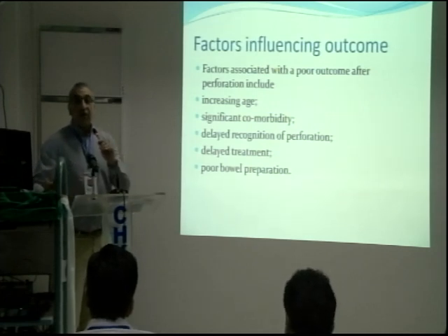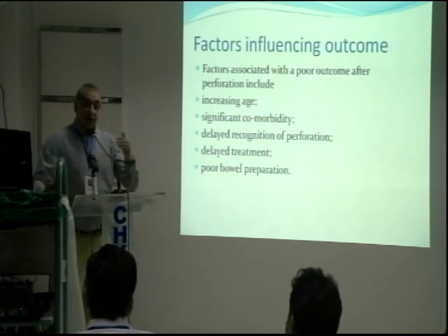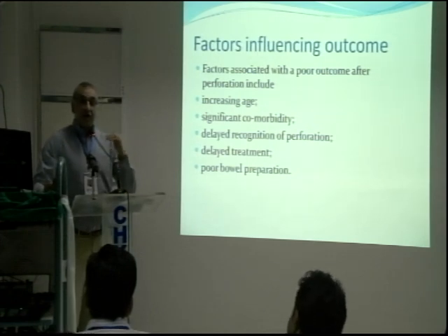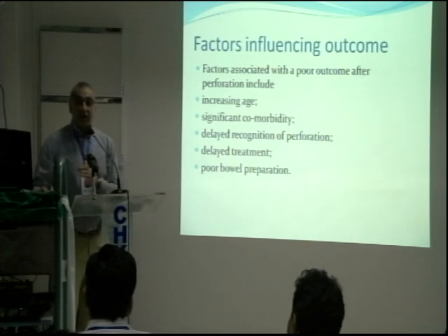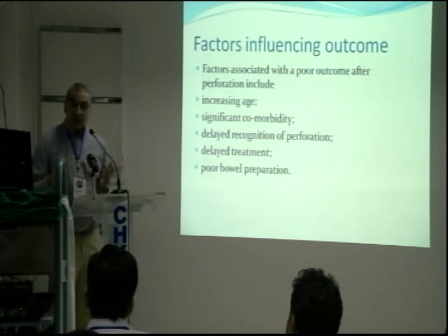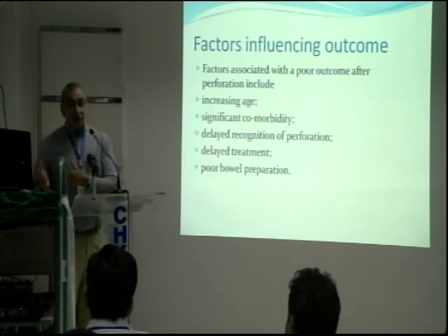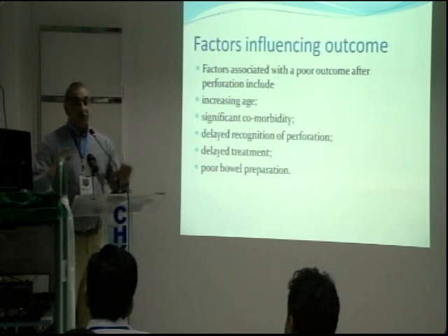So always, remember, these are recognized complications. It can occur to anyone. So if you take all the proper measures after recognizing a complication, then nobody can fault you. If the patient complained of pain after you did a dilatation or polypectomy, the pain was disproportionate and you did an X-ray, you did a CT scan, you called for a surgical opinion, you've done your bit.